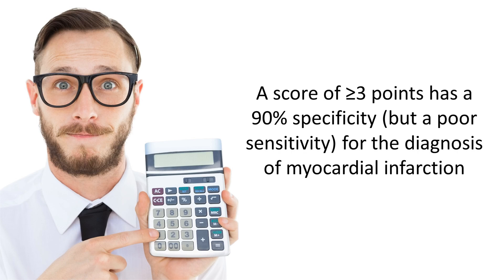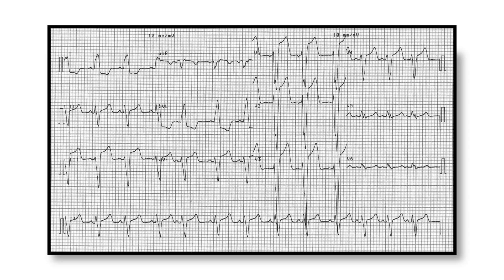Having looked for evidence of these three Sgarbossa criteria, we add up the total points scored. If the patient has a score of at least three points, this indicates a 90% specificity but a poor sensitivity for diagnosis of myocardial infarction. In other words, the Sgarbossa criteria are good for ruling in a myocardial infarction but not so good at ruling it out. Applying the Sgarbossa criteria to this ECG, the patient scores two points because of very marked ST segment elevation in leads with negative QRS complexes — at least five millimetres — but they do not have ST segment depression in the anterior leads, nor ST segment elevation in leads with positive QRS complexes. So their total Sgarbossa score is just two, and they do not meet the criteria for acute myocardial infarction.